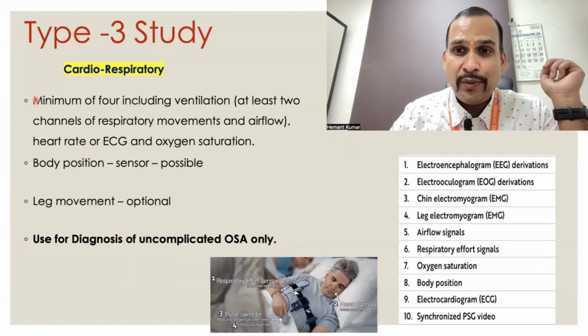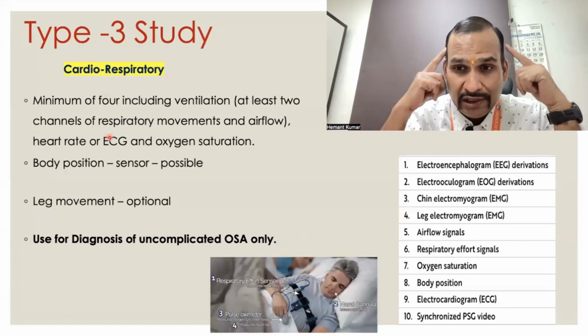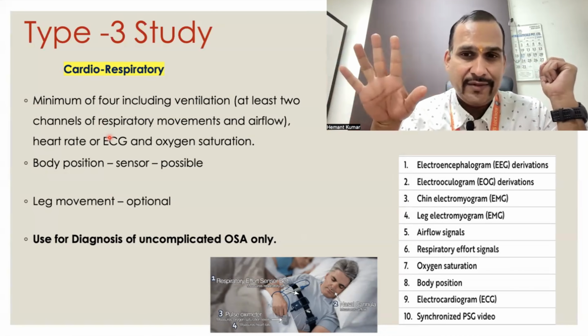This is the most commonly used type 3 sleep study. In this study, there are no sleep parameters. There is no sleep latency, there is no REM sleep, there is no non-REM sleep, there is no sleep architecture.